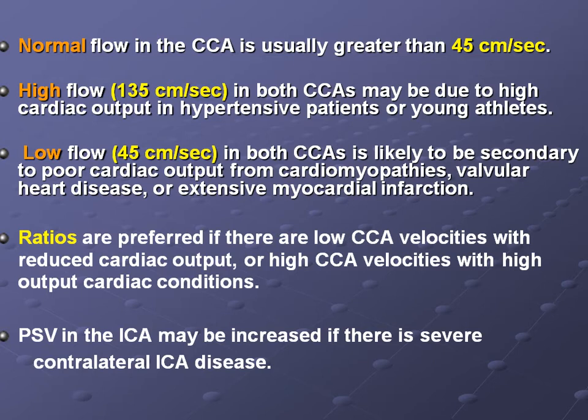Ratios are preferred if there are low common carotid artery velocities with reduced cardiac output, or high common carotid artery velocities with a high output cardiac condition. You use the ICA over CCA ratio. You get a better evaluation.